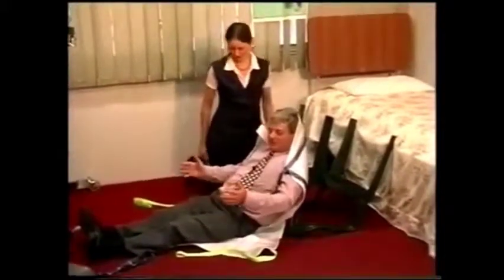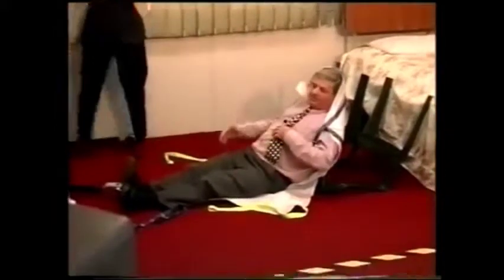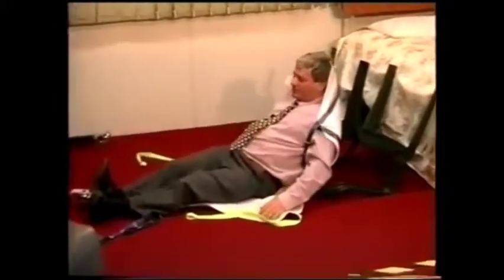Right. Now, here's the patient. They're reclined back in the chair here. They can get their breath back. They've got time to recover. Obviously, before you do this, a nurse would check them out to make sure that it's all right to move the patient before starting. But now the other nurses can get busy and they can get the sling prepared and the hoist in position. Right, so you come forward, and lower the hoist down.